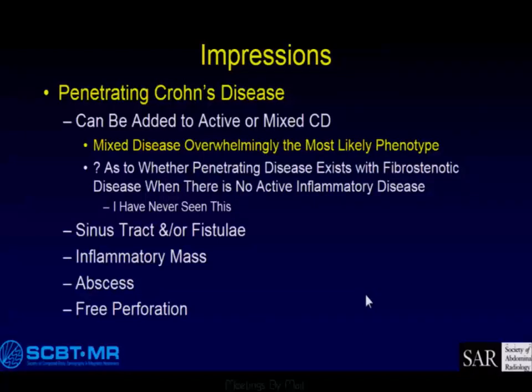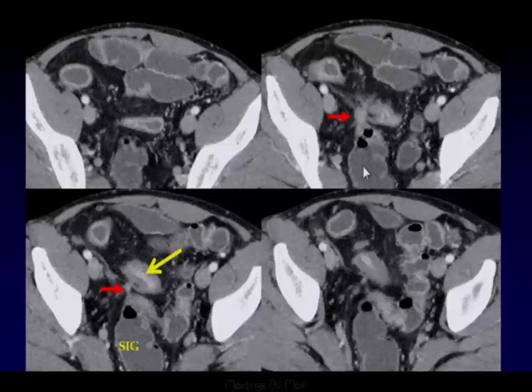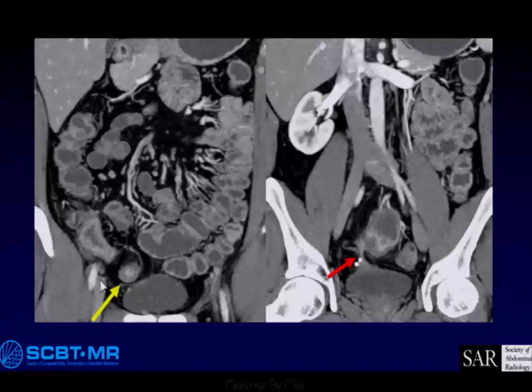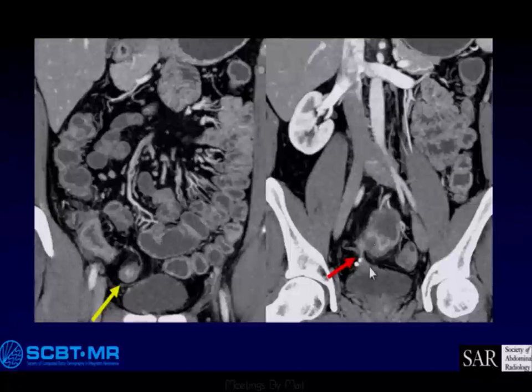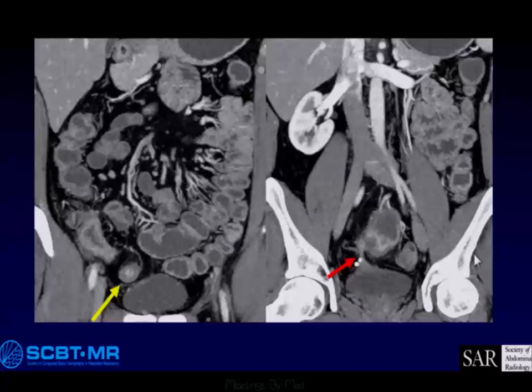Penetrating disease can be added to active or mixed disease, or to stenosis or stricture with active inflammation. You're looking for sinus tracts or fistulae, inflammatory mass, abscess, or free perforation — which fortunately we don't see very often; those patients go straight to the OR. Here's an example: we've got an area of small bowel disease with active inflammation and stricture formation, a fistula to the sigmoid colon, and in the coronal view a fistula going down to the dome of the urinary bladder. The bladder is tented, tethered, with wall thickening. When they resect this, they'll do an en-bloc resection including a portion of the dome of the bladder.